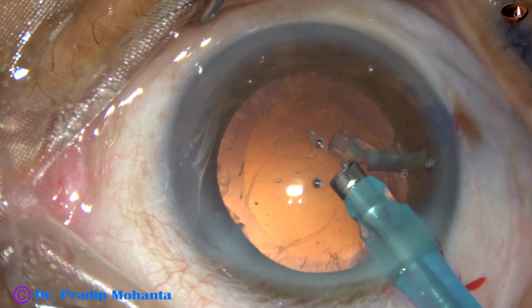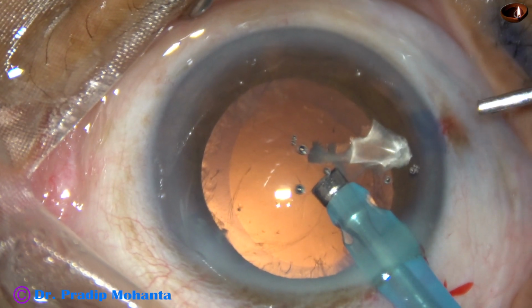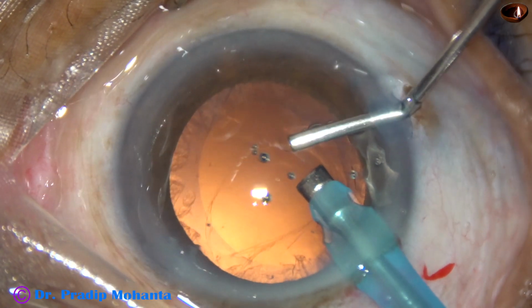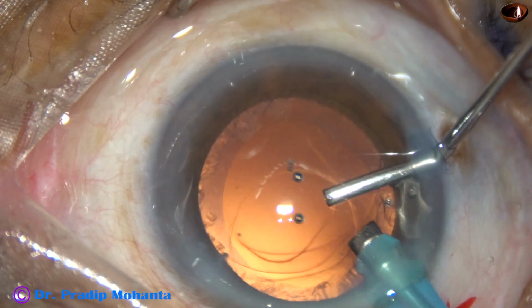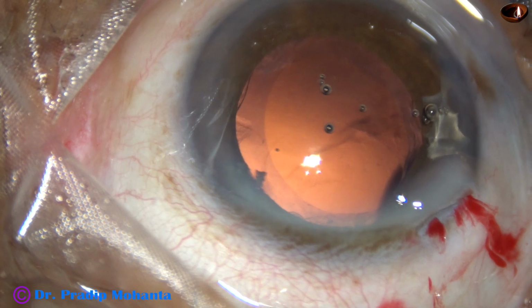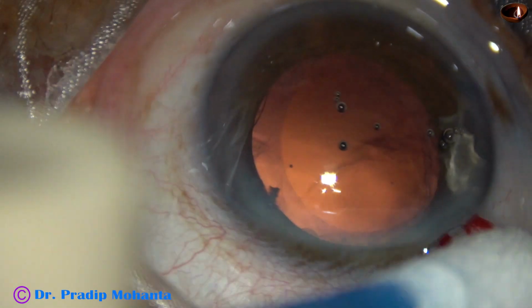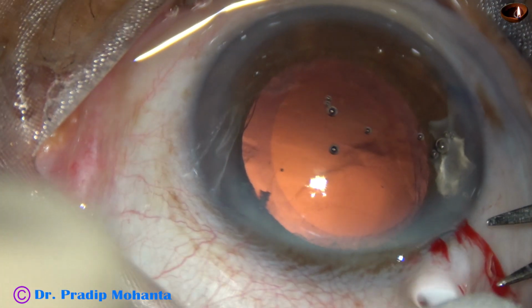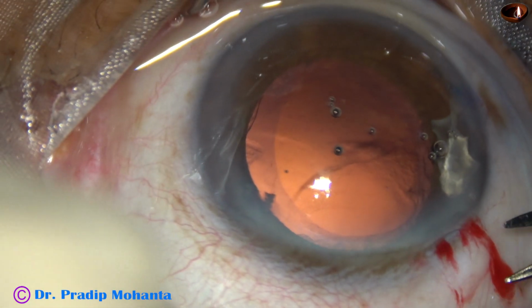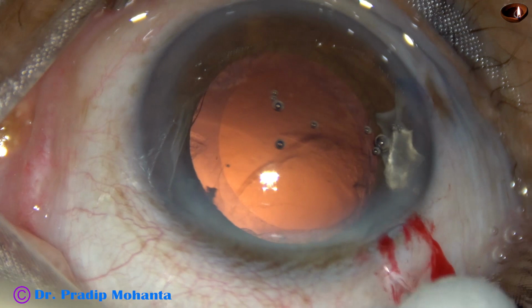So I use reflux because some vitreous strand may come into the Phaco handpiece. Now I inject visco, stop irrigation, and come out. Posterior capsular rent is quite big. Vitreous has prolapsed into the anterior chamber and through the main incision outside. The portion of the vitreous which is outside the main wound is being excised by a Vannas scissor.